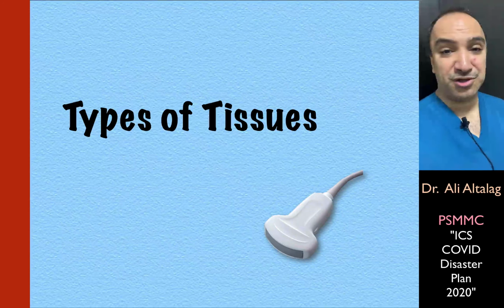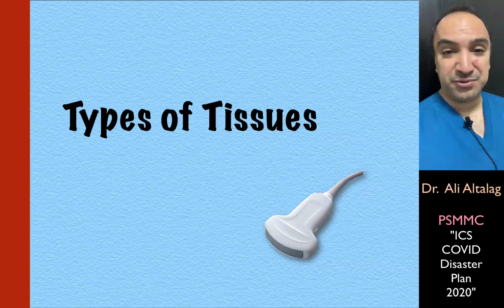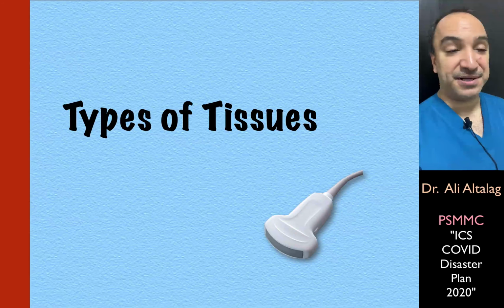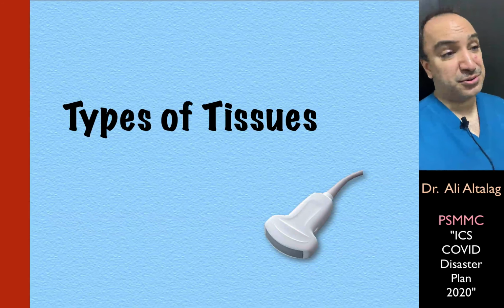By the way, this presentation is meant to be a refresher to those who have experience with ultrasonography, and is considered an introduction to those who do not have that experience. So tissues are divided into three or four, I don't know, maybe five types.